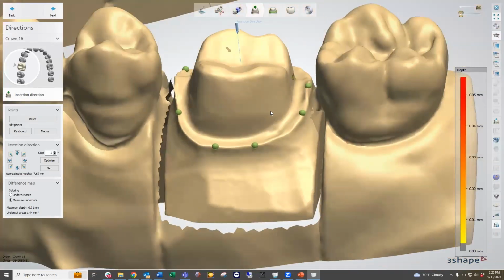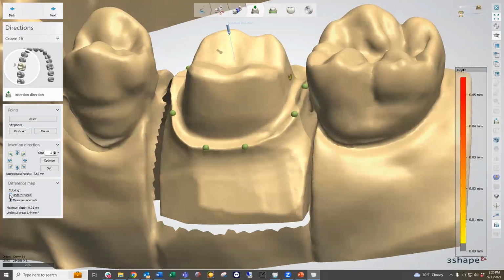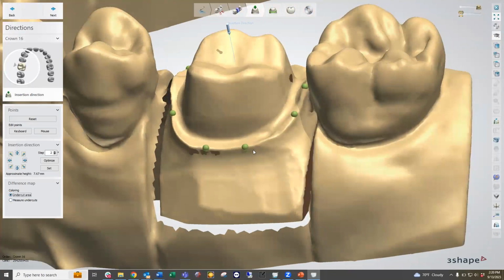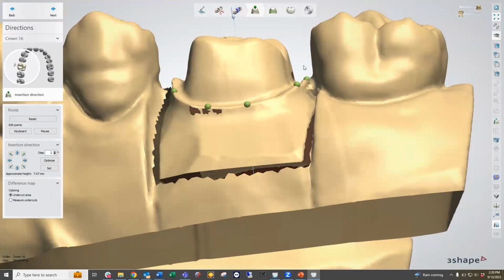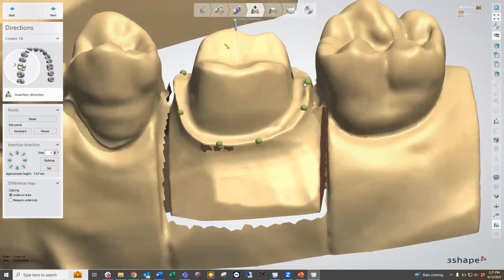Typically, what we don't like to see is any of the undercut areas encroaching or passing through the margin line, because that will create an area in which the unit is not going to be able to seat down or fully close the margin, because there are impeding aspects of the preparation or the neighboring teeth causing it to be unable to adapt to that margin area.